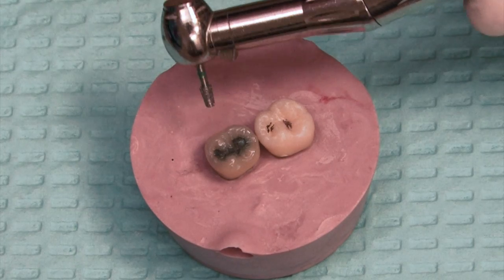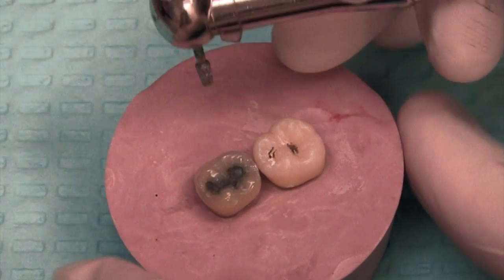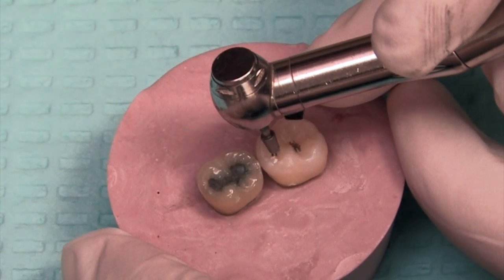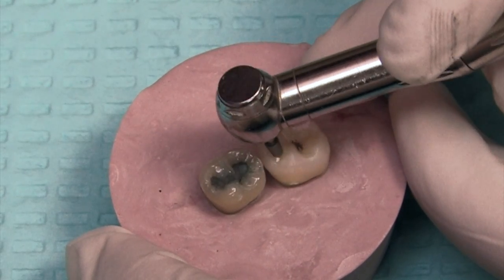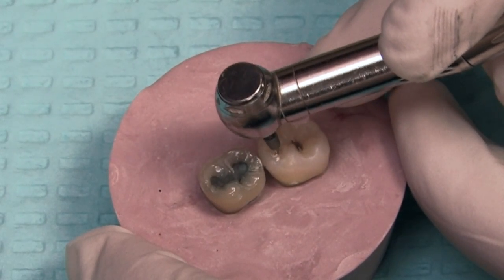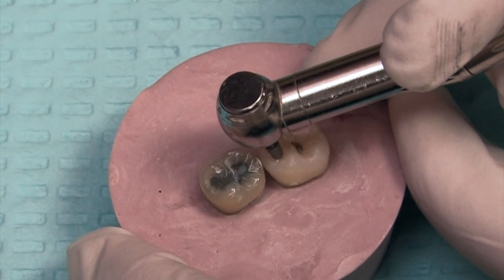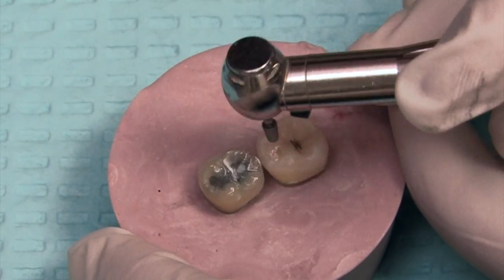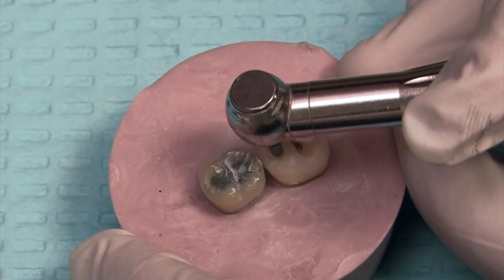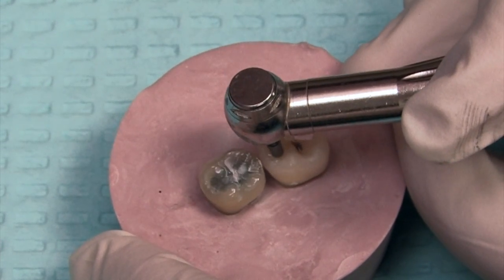When I'm going in with my prep, I'm going to use this kind of fat diamond bur about 80-90% of the time. It just does a good job of efficiently removing the area of decay and unsupported enamel. For this video, I have turned off the light on the handpiece, I'm not using water, and I'm not using my loops. I'm actually prepping from kind of a distance, so it's going to be going a little bit slower than in a real live clinical setting.